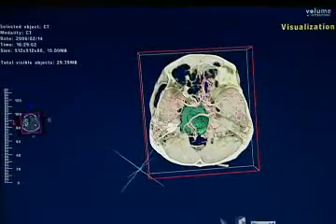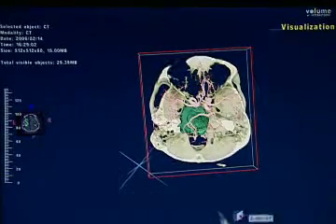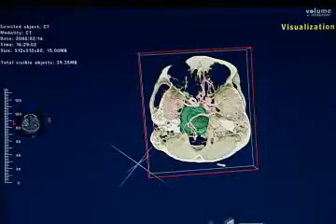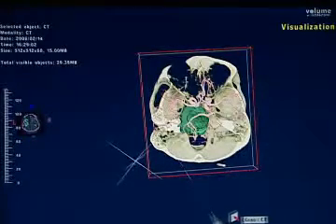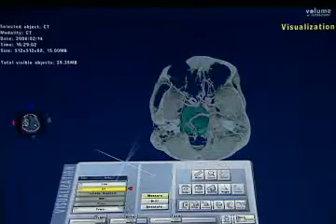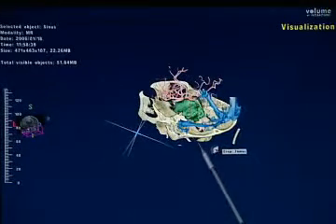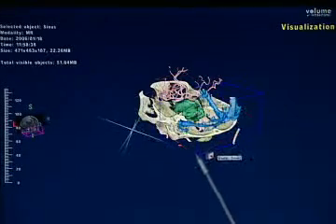And in this situation, as you bring it down, you can see the otic capsule, and you can surmise that this will be the area of the bone you're going to drill from a petrosal approach. And of course you can put in the venous sinus, because if you're going via a standard skull-base approach, the venous sinus will be critical. You want to know whether there's a high-lying jugular bulb. If you're going to go via a translab approach, you want to look at the sizes.